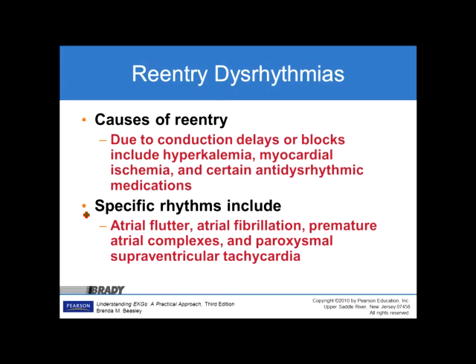Causes of reentry due to conduction delays or blocks include hyperkalemia, myocardial ischemia, or certain anti-dysrhythmic medications. Specific rhythms include atrial flutter, atrial fibrillation, premature atrial complexes, and paroxysmal supraventricular tachycardia. The word paroxysmal means we can see it come or go — it doesn't sustain itself all the time — but whenever we do get the SVT, it becomes problematic.